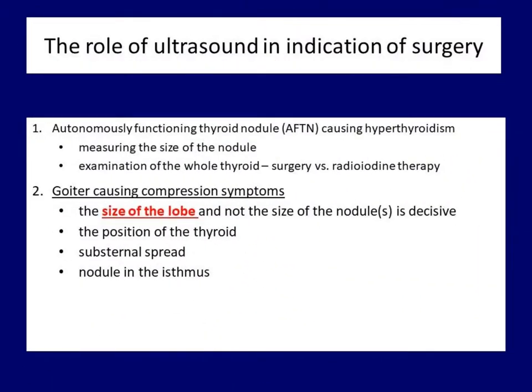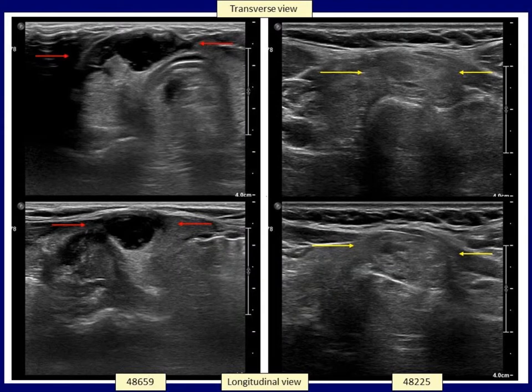Our approach is different for a nodule located in the isthmus. Because the space between the skin and the trachea is narrowest here, a much smaller nodule can cause patient complaints. The case on the left shows a small nodule causing an uncomfortable feeling of pressure. A lesion of similar size on the right caused no problems. There is a significant difference in the sensitivity of individuals; however, the patient on the left was also much thinner, so the nodule reached nearly the level of the skin, while in the right case it was located almost one centimeter deeper due to adipose tissue.